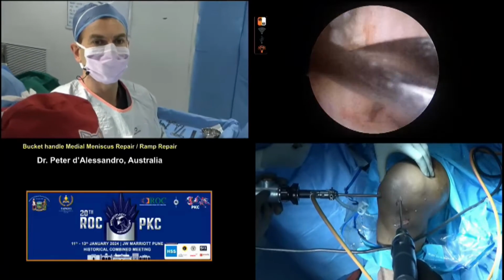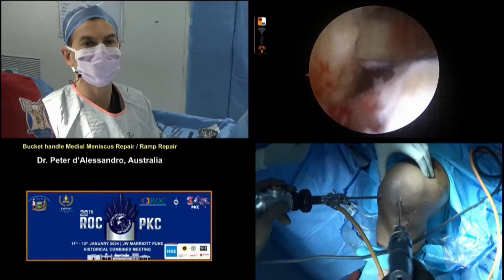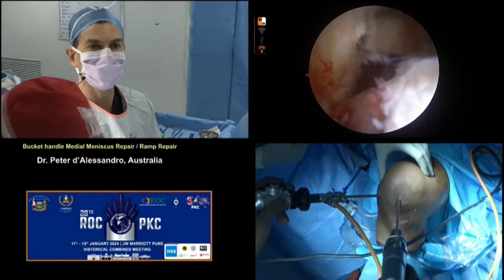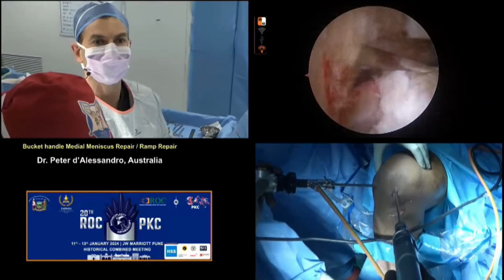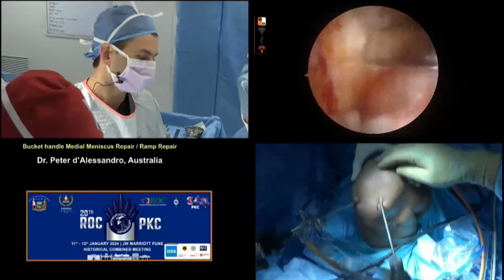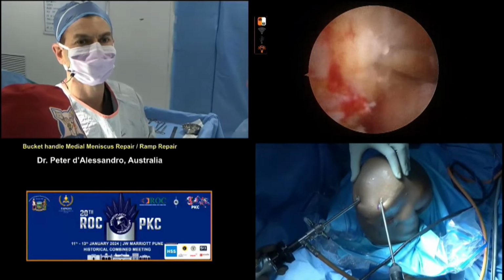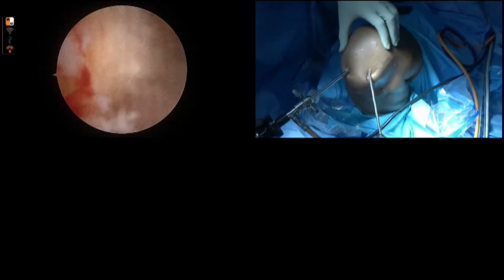So we can see here, I am going to do the femoral tunnel ACL. I've got a solid 4.5 millimeter drill. I've got my pilot position here. The guys are flexing up now for me. Thank you very much, guys. Flex, flex, flex, flex. Bit more flexion there. That's great. Thank you. So I'm going to use my solid 4.5 drill.